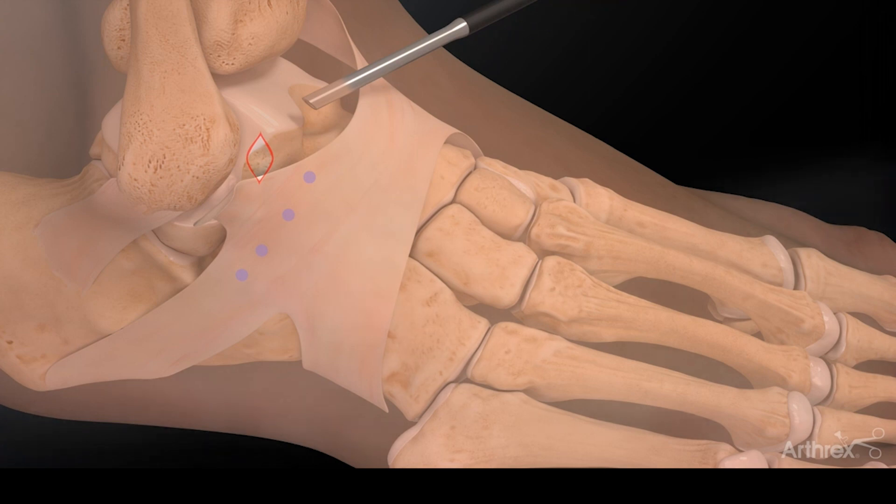The neat thing about this procedure is it allows us to visualize the ankle joint. We can assess the cartilage, we can look for damage and defects, and we can treat those. We can also clean up all the inflammation and any impingement sites, and assess the ligaments that are inside the ankle joint themselves.